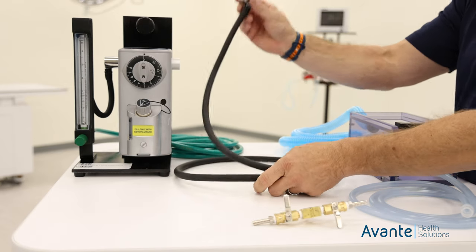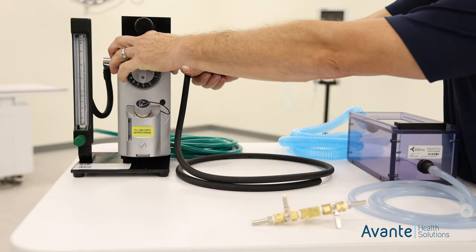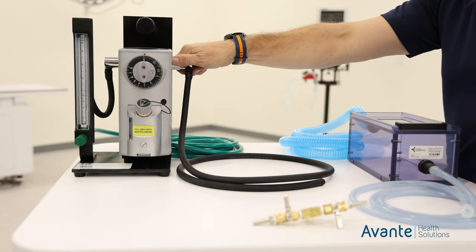Now we're going to hook up our outlet. We take our outlet cap, push in, and gently twist as we turn. That'll get a snug fit on there.